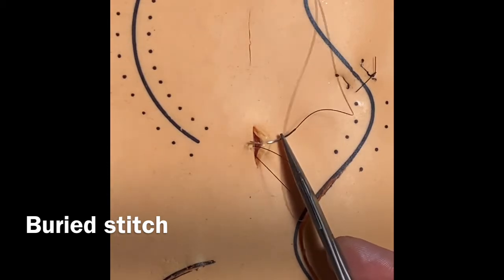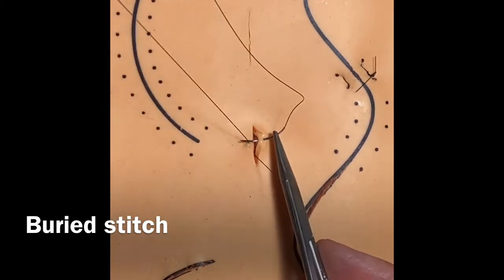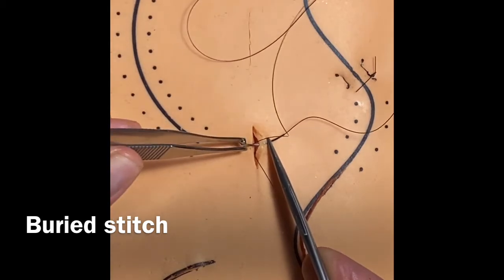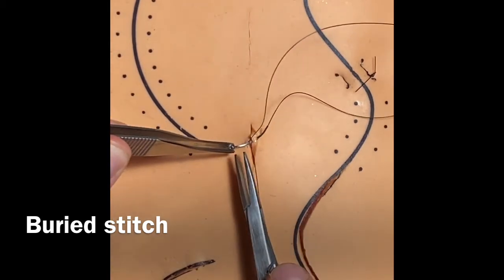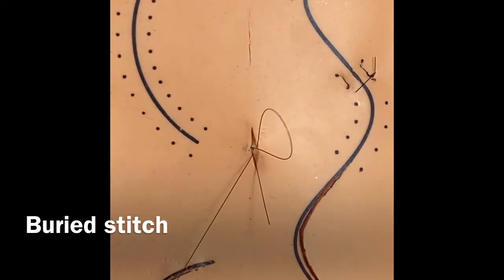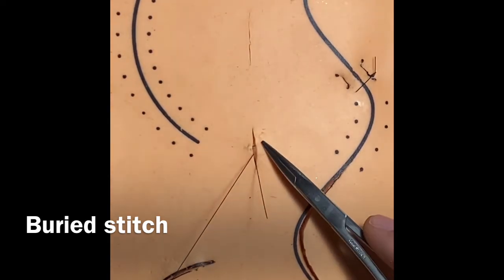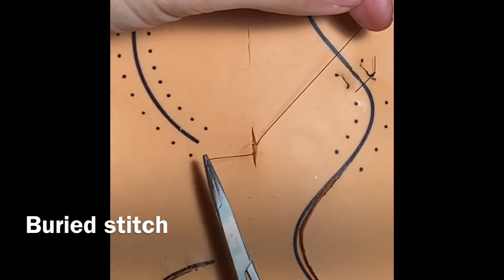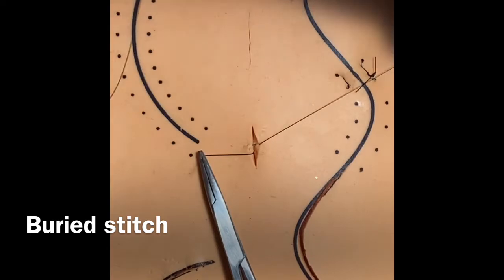And I'm going to move my loop out of the way so that my needle can come out on the same side of the loop as my tail here. Okay. So that should pull down nicely. Yep, see how you can't see it? And so here's what I have left, my tail and my suture here.